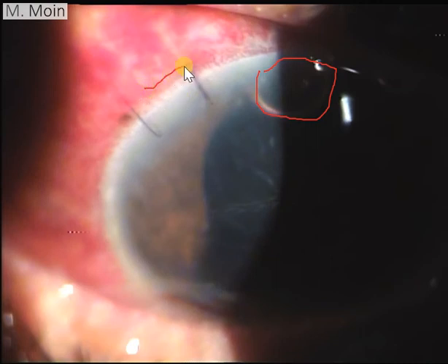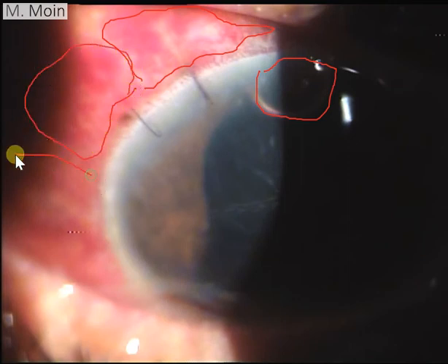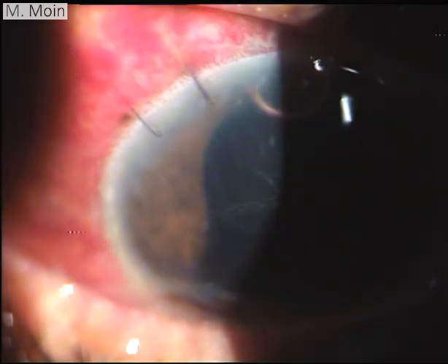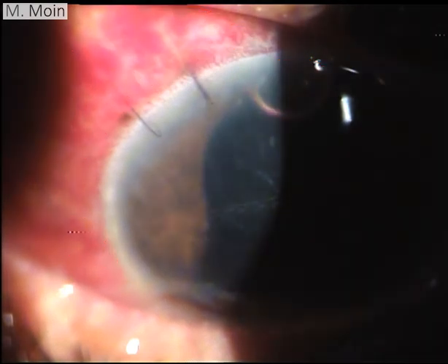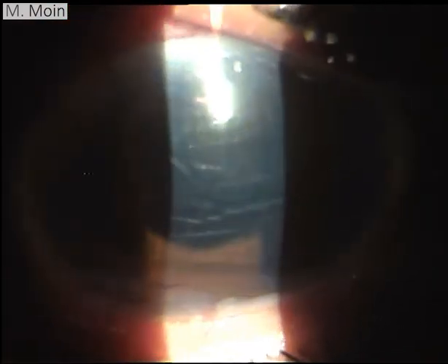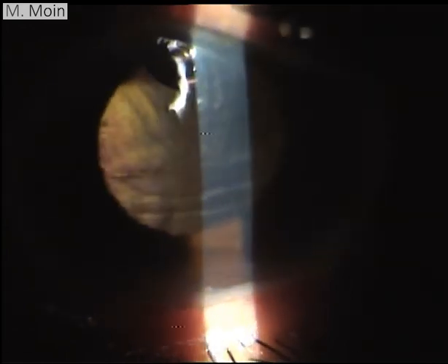The other thing you're seeing over here is an area of subconjunctival hemorrhage which was present because of the incision we had given over this area. So these are areas of subconjunctival hemorrhage along with ciliary congestion which you're seeing in this patient. All these things are very relevant when you're examining the patient and describing it to your colleagues or to examiners in your examination. Then you need to go on to a higher magnification and see.